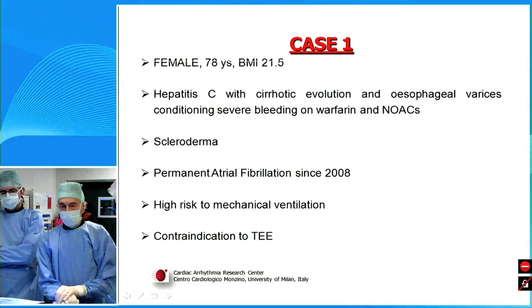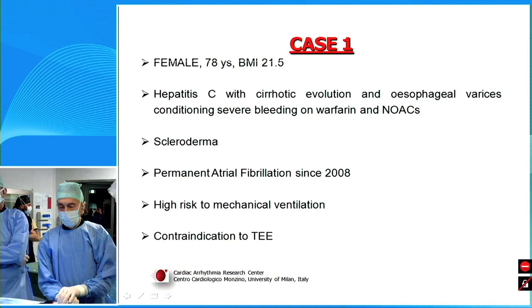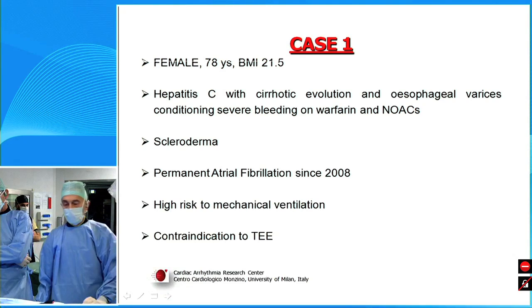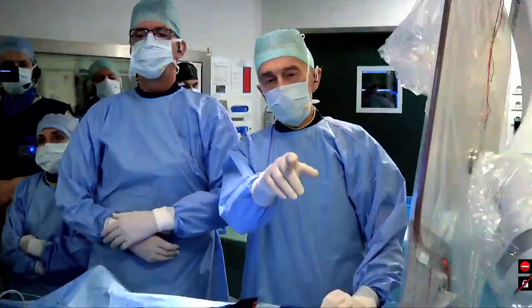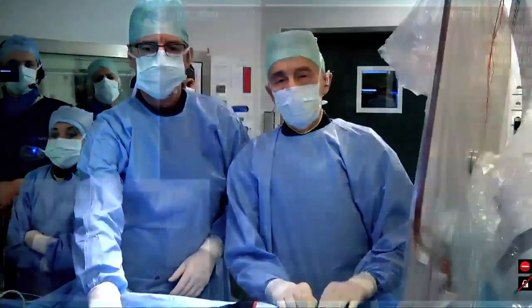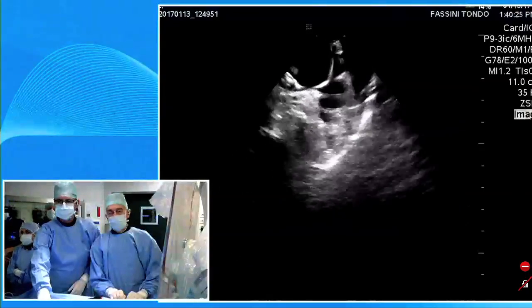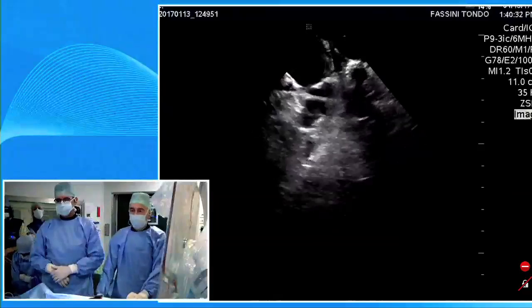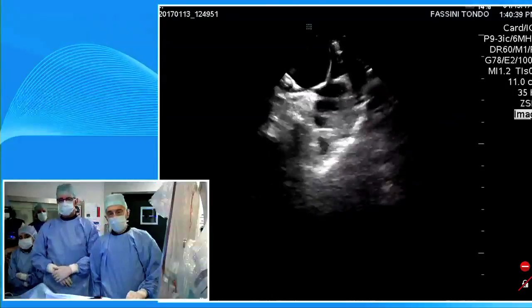Another feature I'd like to highlight is that when varices in the esophagus are documented, there is a high risk with mechanical ventilation. So we have elected not to use the TEE, but the ICE. We are now with the ICE in the left atrium. We cross the septum one time with a transseptal assembly, and then cross again with the ICE transducer in order to have a good view of the left atrial appendage and take measurements.